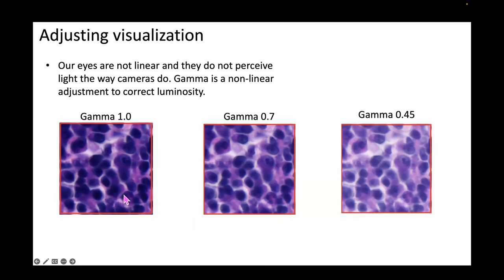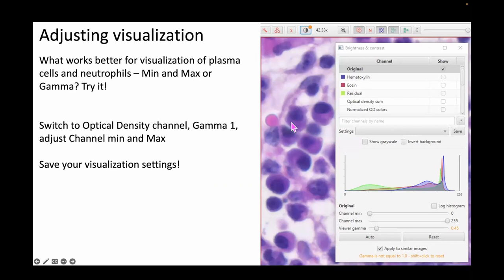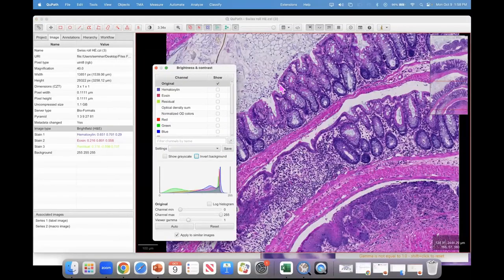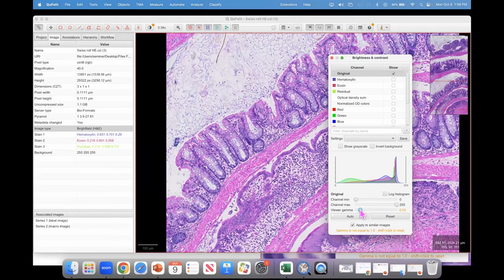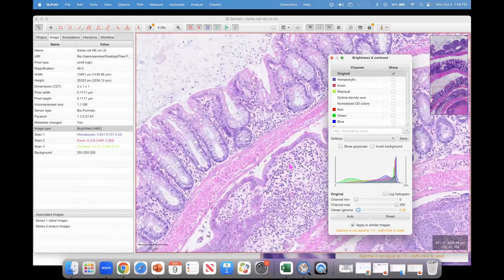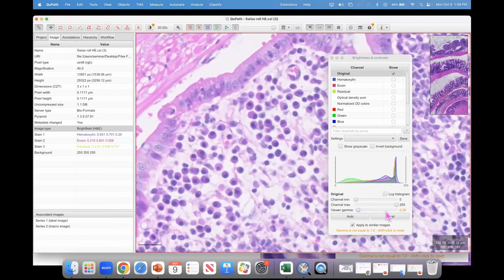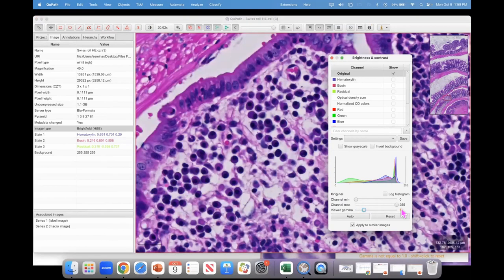I can see a neutrophil that's a lot easier to see with the adjusted gamma than on the darker image. Plasma cells are also easier to see when you have a lower gamma value — the image becomes a little brighter. The idea is that the way you see through the eyepieces of the microscope versus the way the camera records data are two different systems, and a linear gamma on the camera does not translate to our human experience. This allows you to compensate for that. Go ahead and try it in QuPath — go to Brightness and Contrast and move that slider. Hold Shift and click to go back to the original.